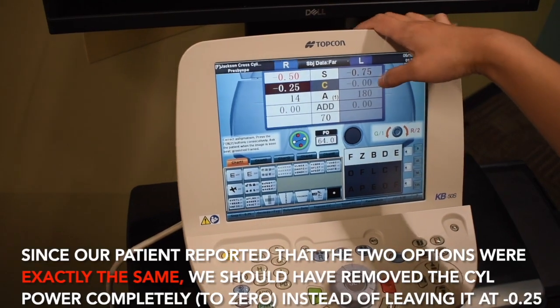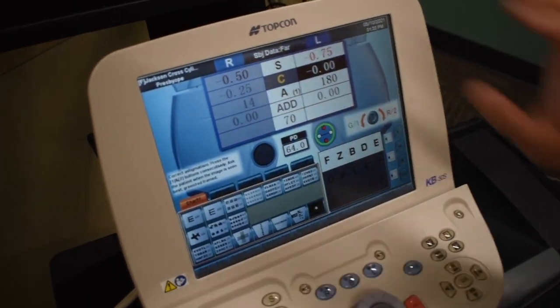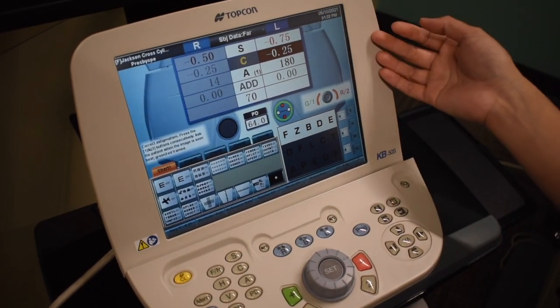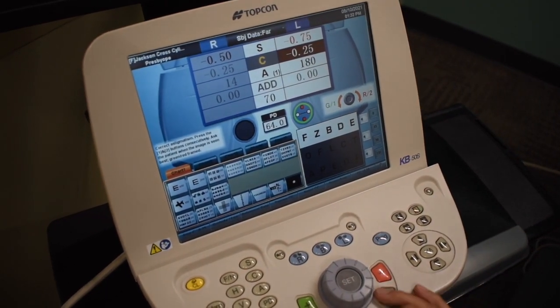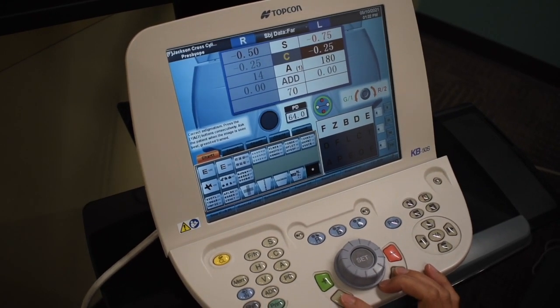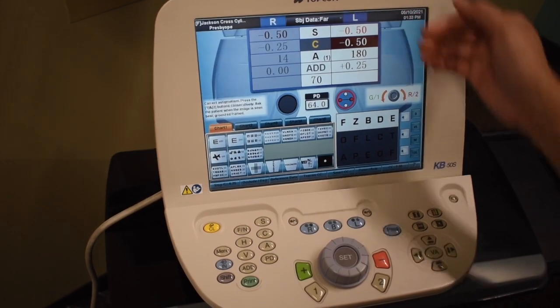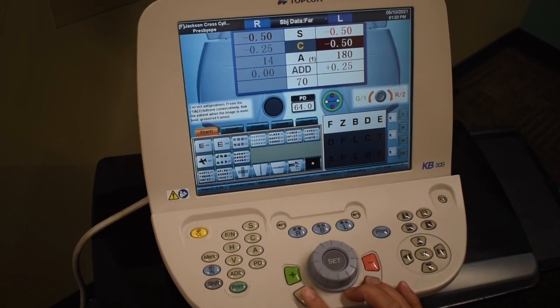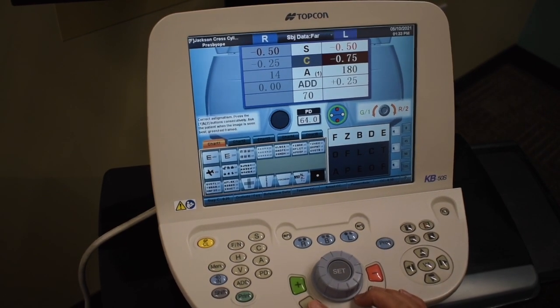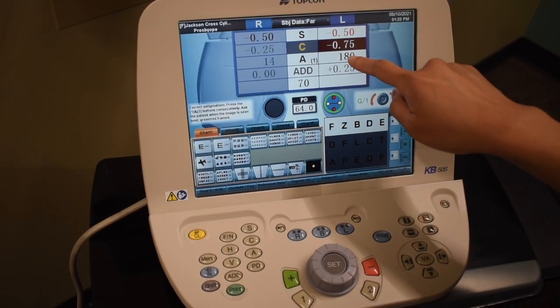Now we're going to move on to his left eye. It automatically occluded the right eye and opened up the left eye. Since he didn't have any cyl as we found on retinoscopy, we clicked in minus 0.25 and we're going to do JCC here. One or two — patient chose one. He accepted that cyl, and it automatically did the spherical equivalent. How about one or two — patient chose two. And one or two — patient chose one. So we wanted to go back down first on power.